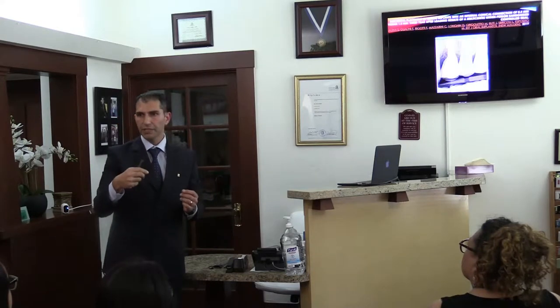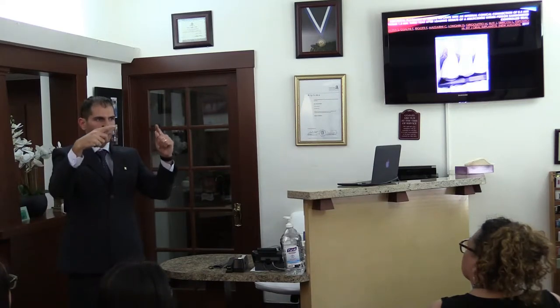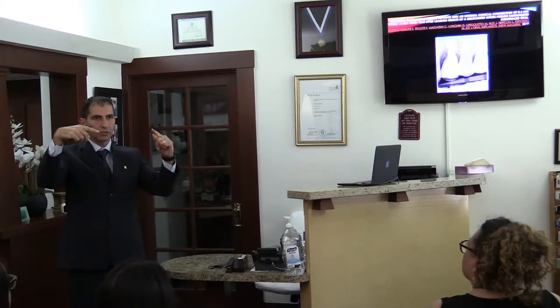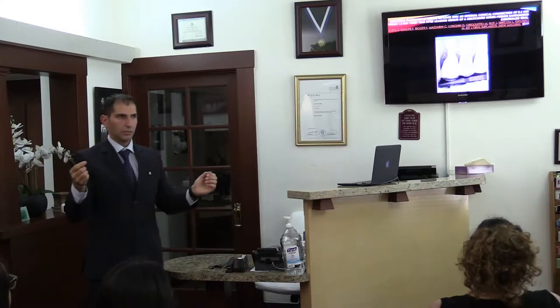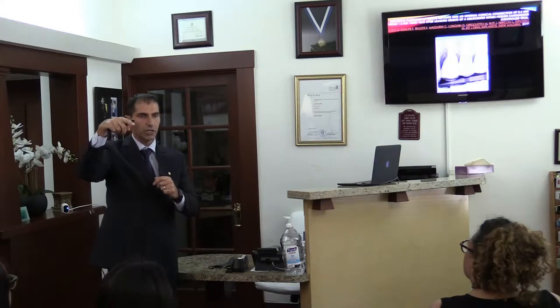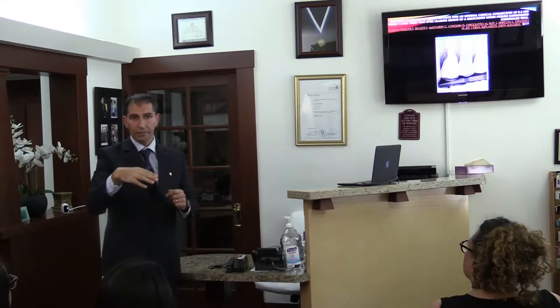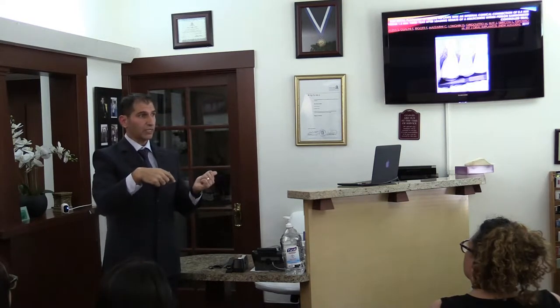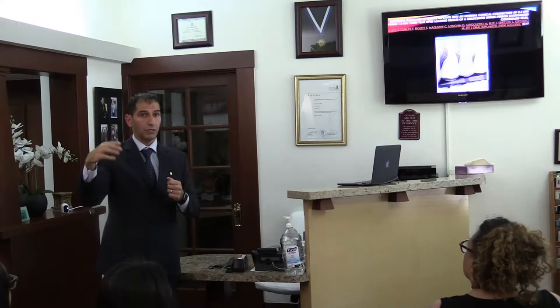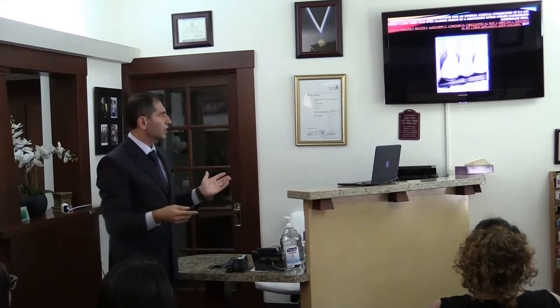When I want to place an implant in an immediate tooth extraction situation, the bone is scalloped. The facial bone and interproximal bone are different heights, correct? Am I wrong here? No, the bones are scalloped, right? They follow the gum, so interproximally the bone is higher. So if I place my implant at bone level in immediate placement, I'm going to go with the facial bone. So I'm automatically subcrestal on the interproximal, right? Am I doing the math correctly? Yes. So that was the struggle.